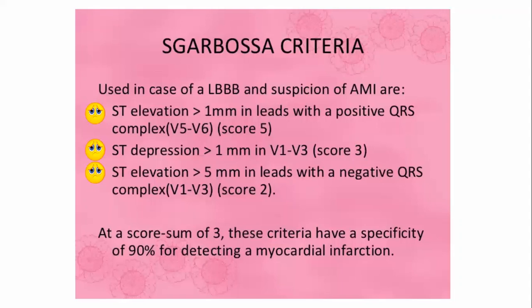And this is why you would need to consult cardiology very quickly. So we just wanted to put this in so you could appreciate the circumstances with which you have to respect left bundle branch block and how important it is to document it in your problem list, in your office problem list or in the hospital problem list.